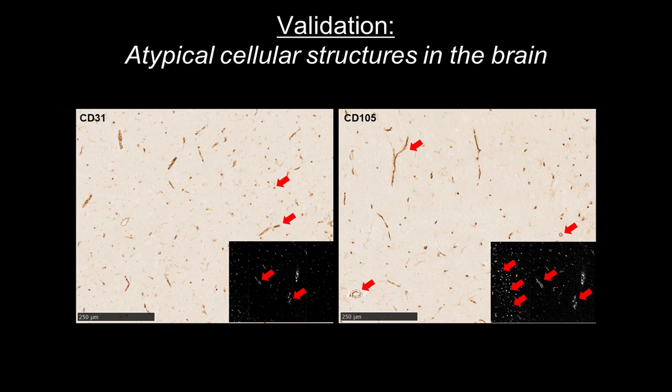And it's not that you can't do that here, it's just a lot of the structures in the brain, particularly some of these things that were non-cellular features, things like the vasculature that I'm showing you right here, don't have typical shapes. And so it took a little bit of extra elbow grease to get these things going.